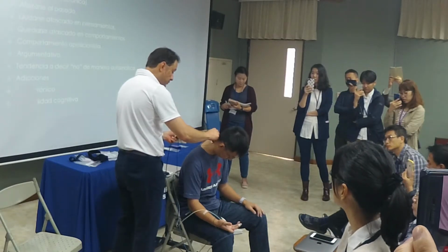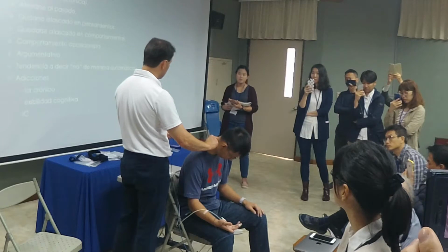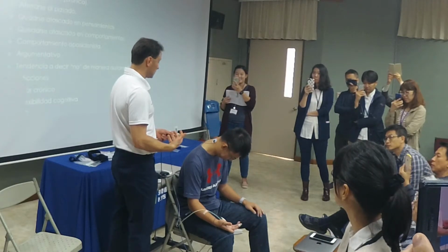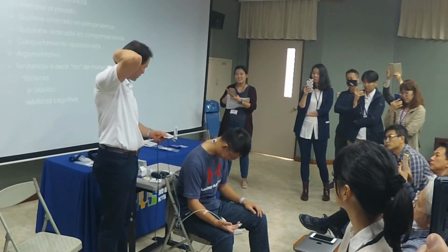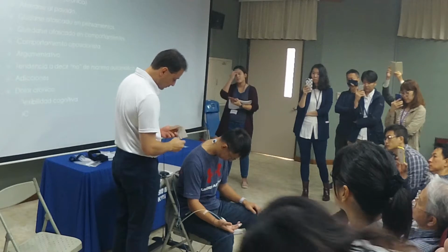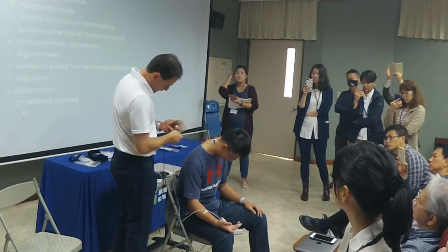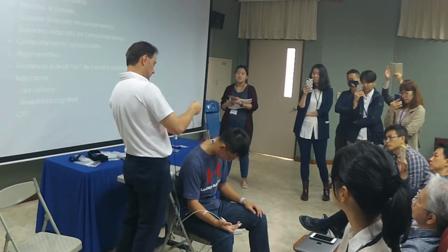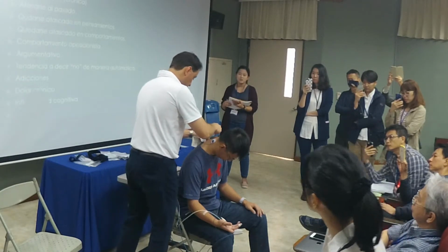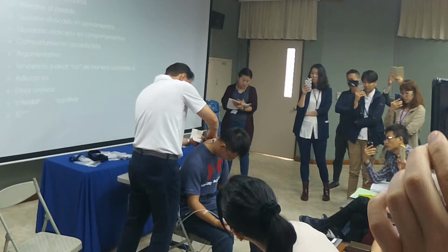And I want to make sure there's not a lot of hair in the area underneath, because then when I pull them out, it can be really painful. Especially if women have more hair back there, so it's kind of painful. But I can show you where you can take them off by reducing that. And then we have the left for the shoulder. Just like that.